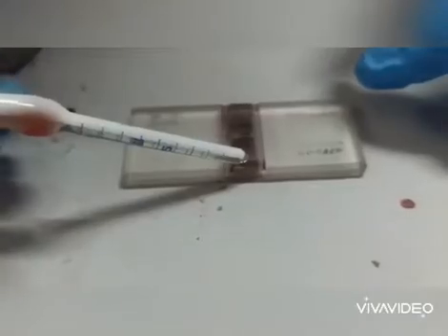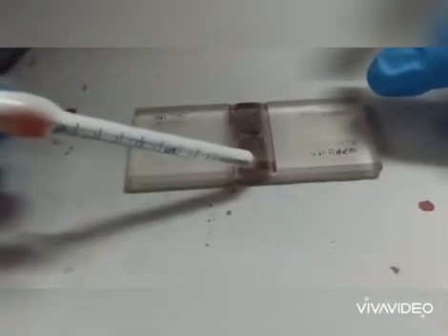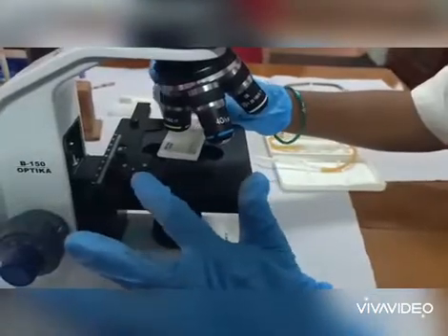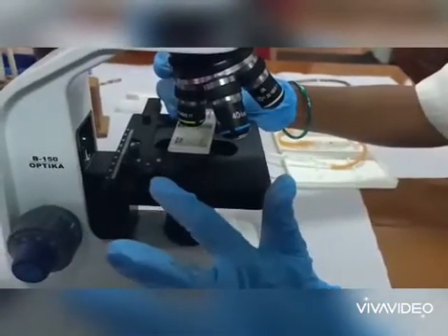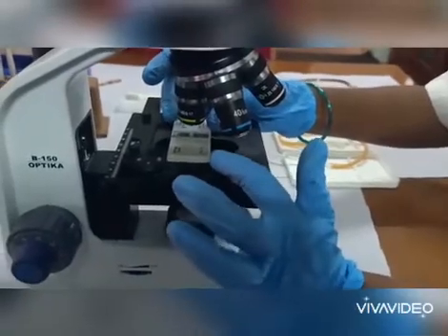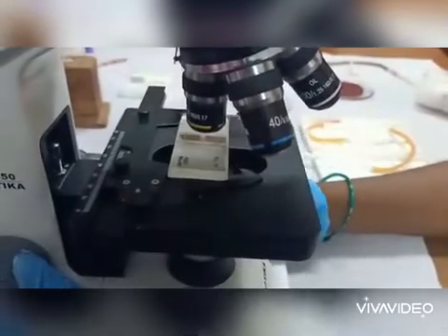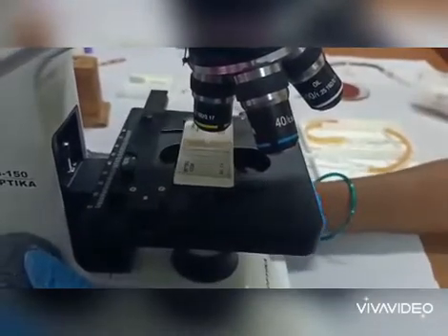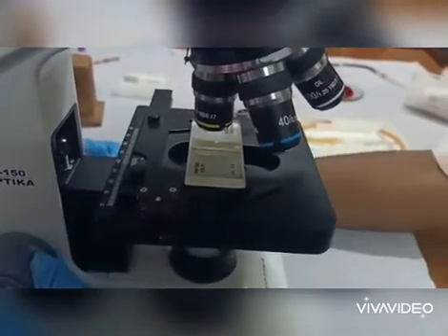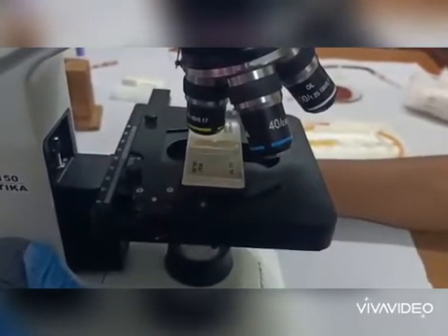A small drop has to be placed in between them. With the help of the side clip we have to fix the space in the slide, and with the help of the leveling screw on the stage we have to adjust it, and with the help of the coarse adjuster we have to focus the lines appropriately.